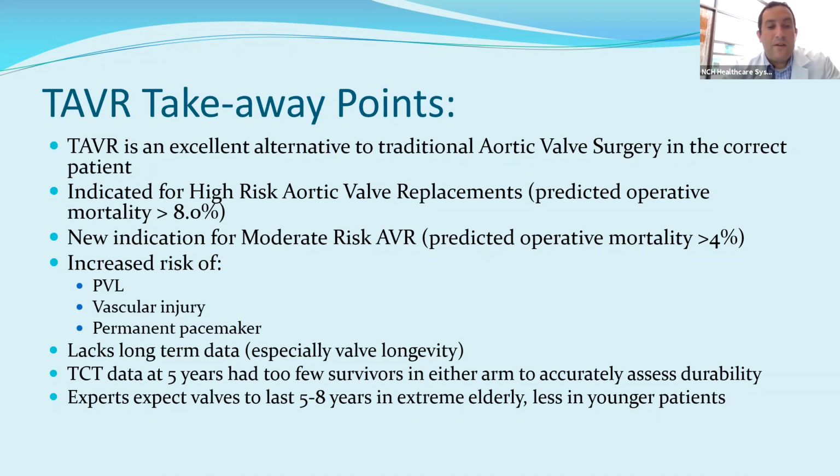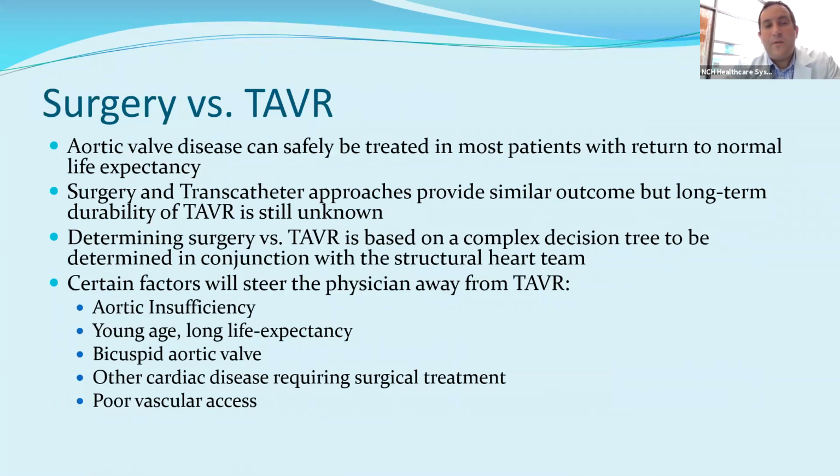What it comes down to is I'm telling my patients, you can expect 5 to 8 years. It may go longer, it may not. We just don't know with these valves. In younger patients, they should truly consider a surgical valve if they are really worried about longevity and transcatheter valve is going to be an issue for them. We just don't know that answer. So I think it's worth keeping both options in mind and determining what's the right option for you. We can do it minimally invasively, or we can do it transcatheter, get similar results.